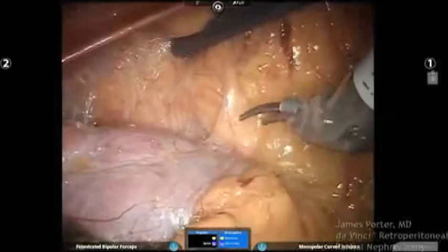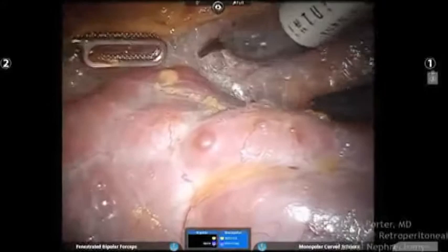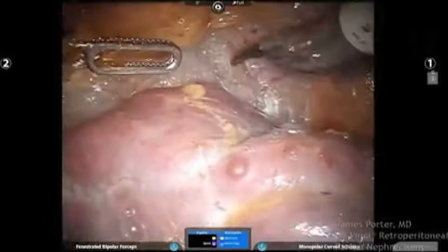And in this case, there's really no fat in this woman here. That's the tumor surface right there. So there's not much there. That's actually peritoneum right there, okay? So we don't have a lot here, which kind of brings me to the point.